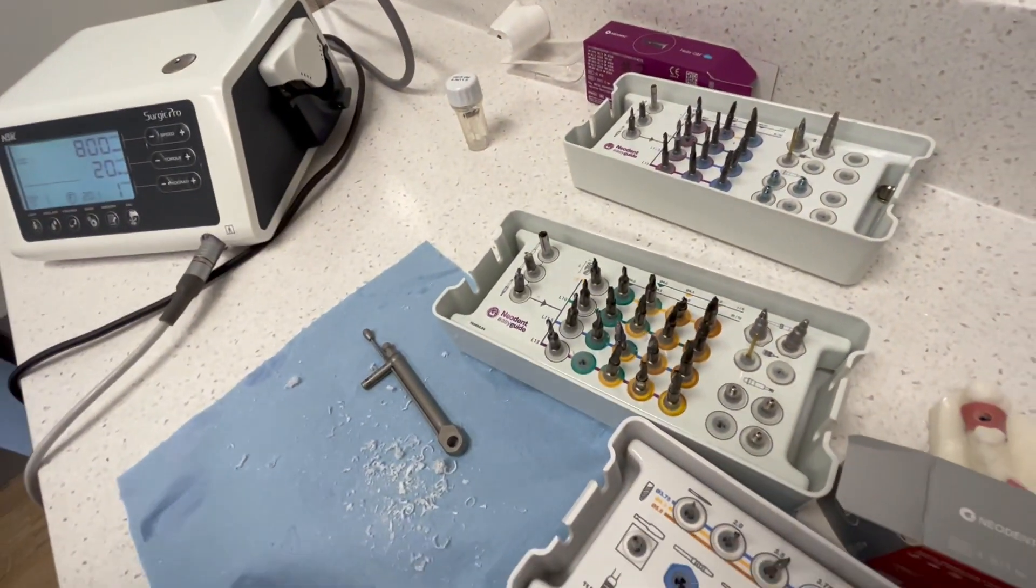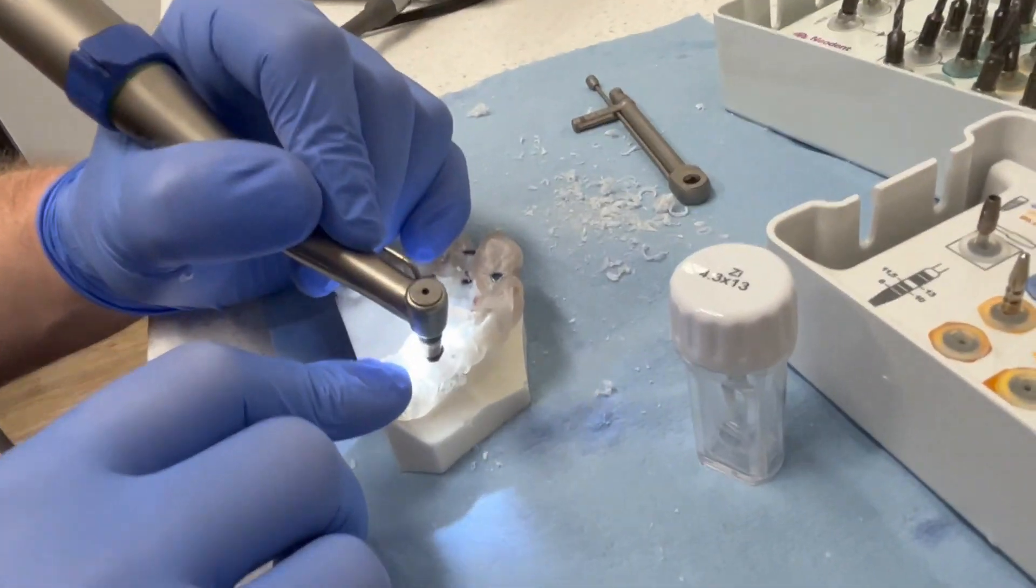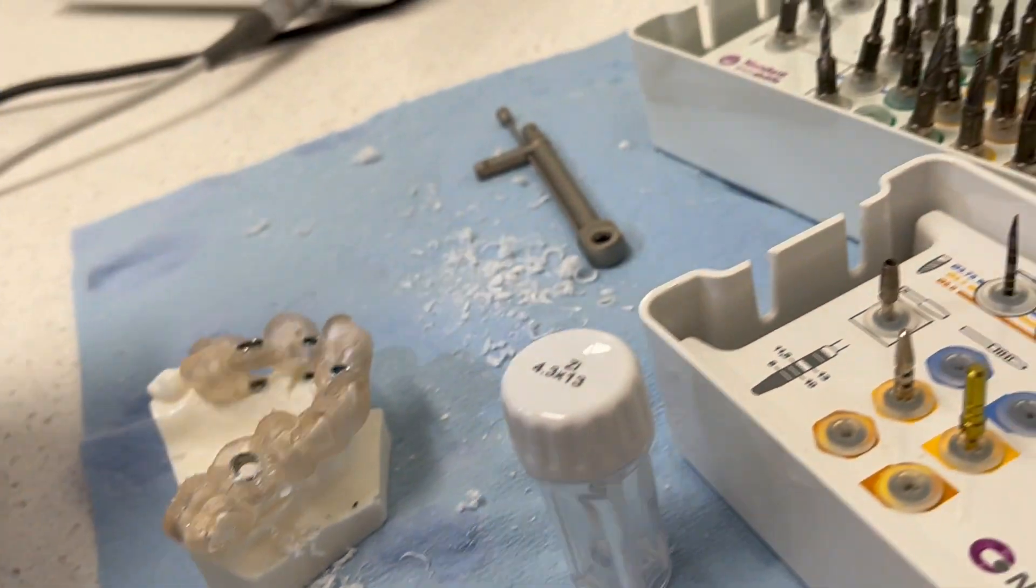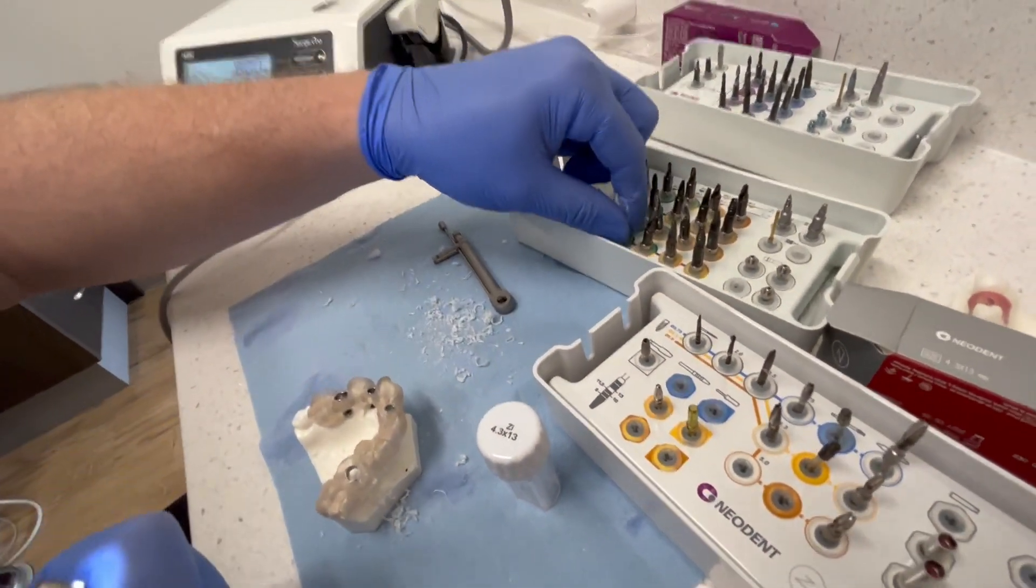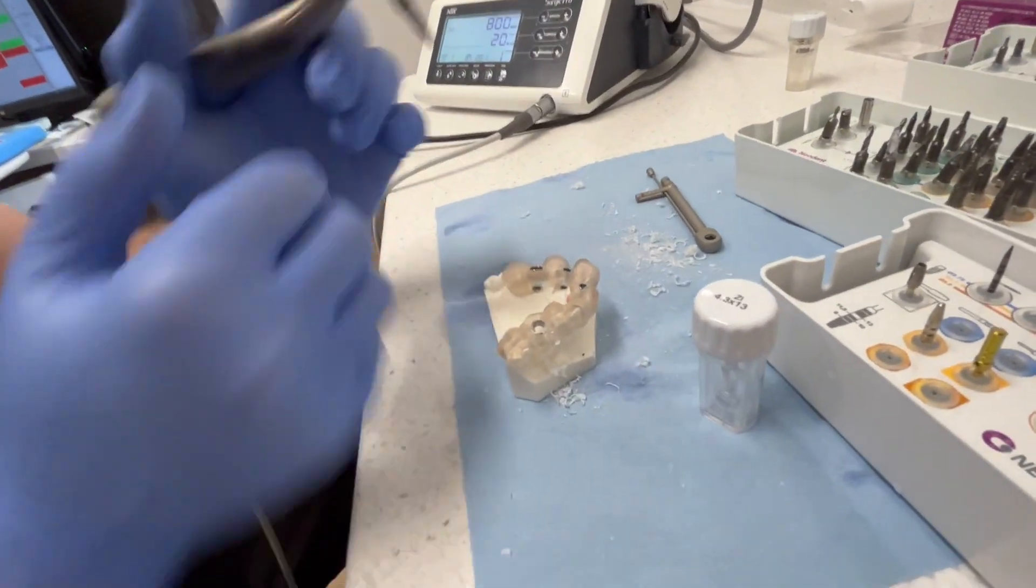Now we're just upsizing. So now this is our 4-0 for soft bone drill. This is our 4-0 for hard bone or 4-3 soft bone.